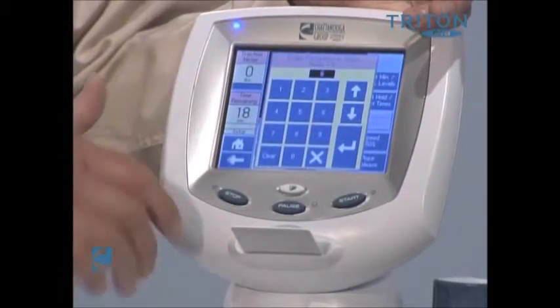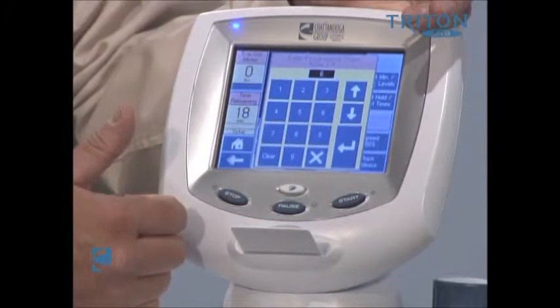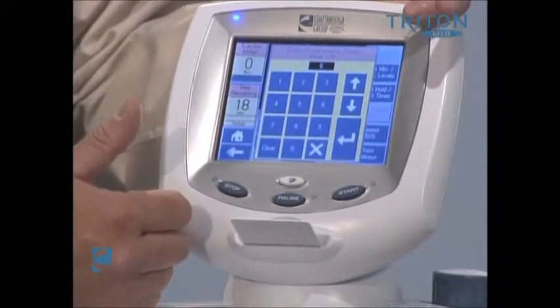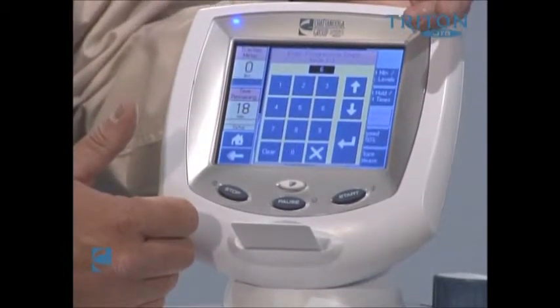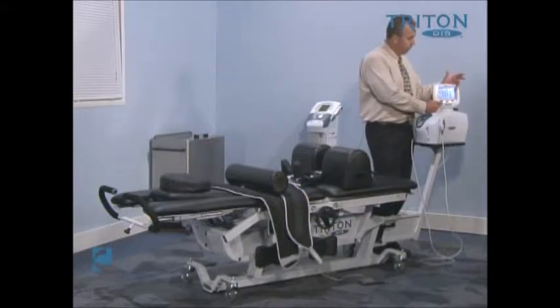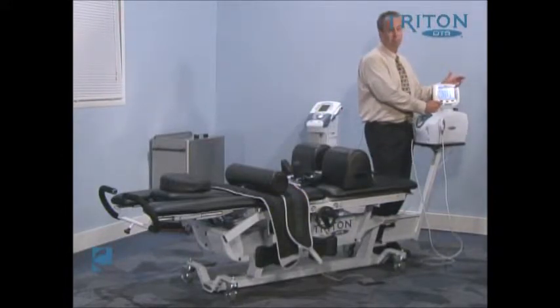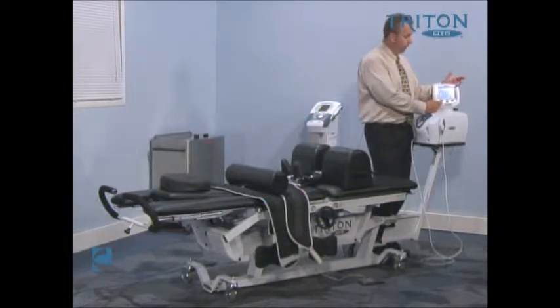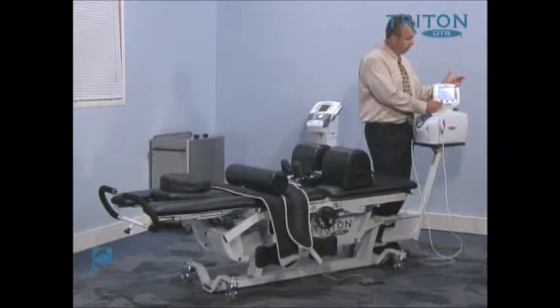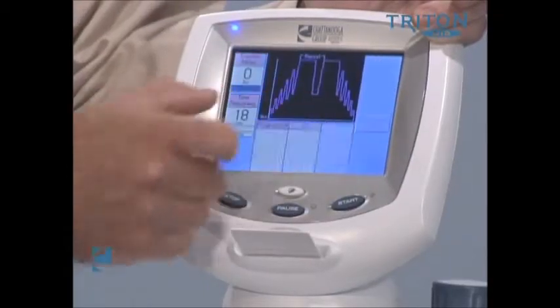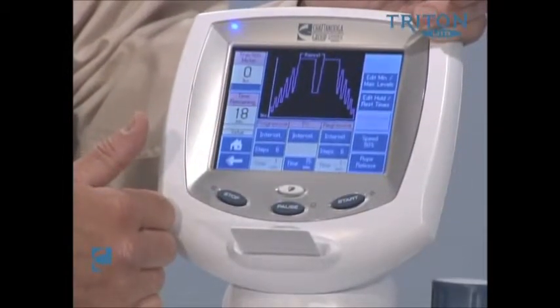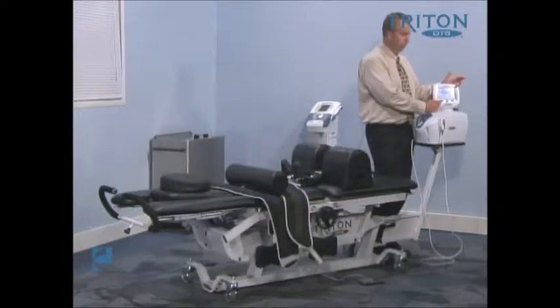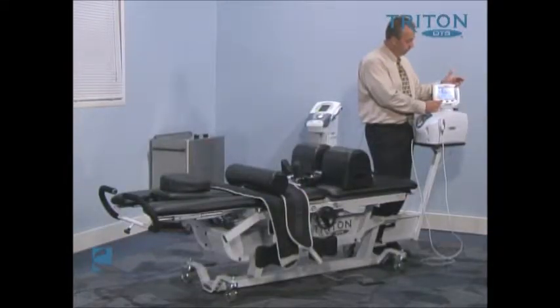If we wanted to provide intermittent or static traction during the progression or regression phases, we have that opportunity. We also have the opportunity to change the number of steps we can take. This progression is the number of steps that will provide introduction to the actual treatment, whether it be intermittent or static traction. We can manipulate the number of steps we would like to take during that progression phase.